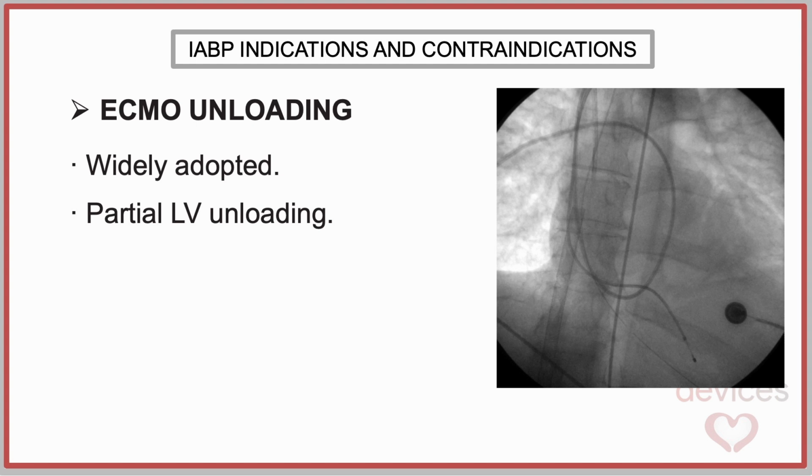One of the main physiological challenges during ECMO support is left ventricular distension. The retrograde flow generated by the ECMO circuit increases afterload, impeding left ventricle ejection, raising end diastolic pressure, promoting pulmonary congestion, and impairing myocardial recovery. The intra-aortic balloon pump, through its cyclical inflation and deflation, can obtain partial unloading in this setting.